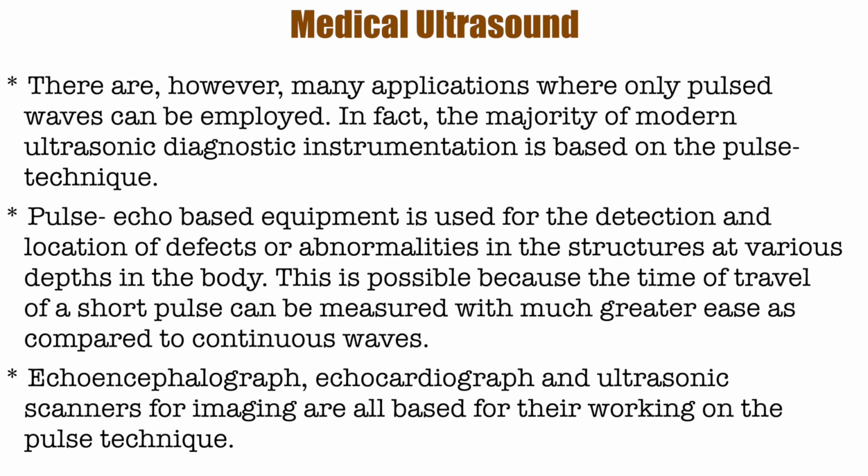Pulse echo based equipment is used for the detection and location of defects or abnormalities in the structures at various depths in the body. This is possible because the time of travel of a short pulse can be measured with much greater ease compared to continuous waves.